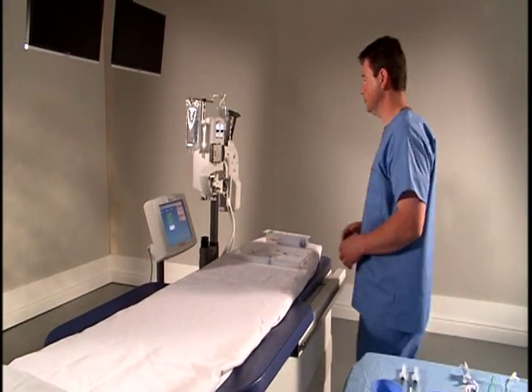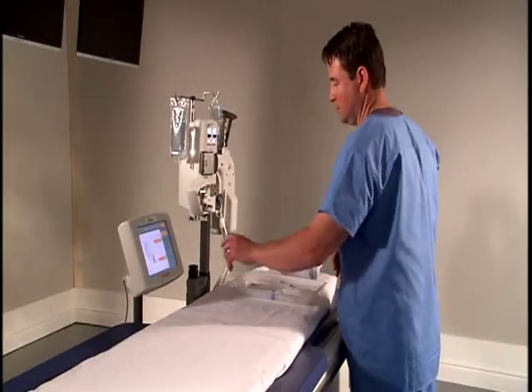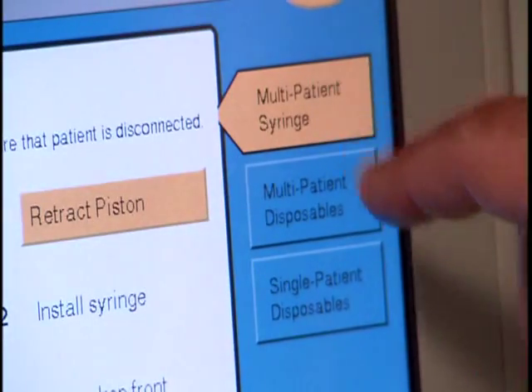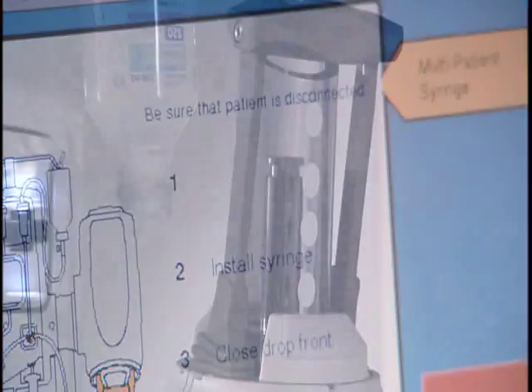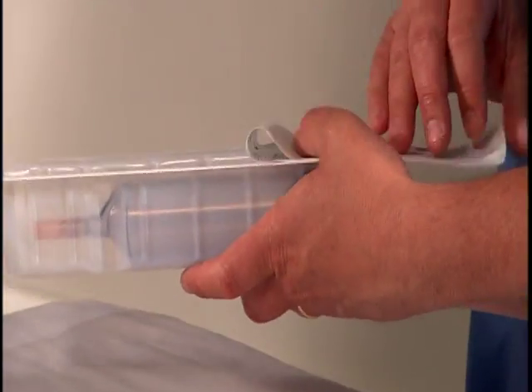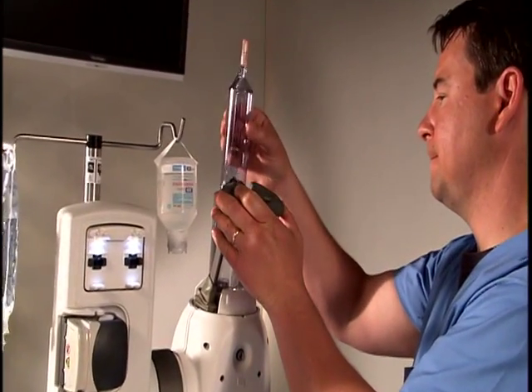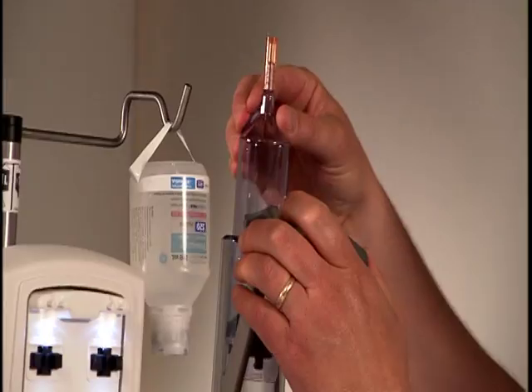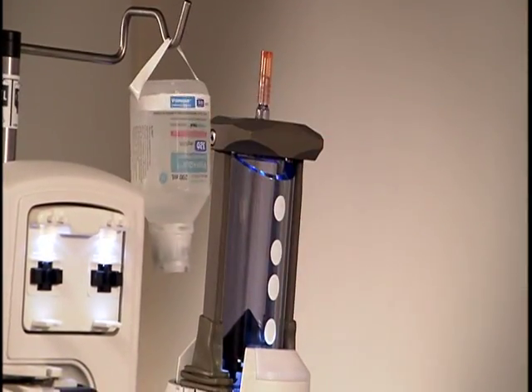To install a syringe, touch Setup on the protocol screen. A setup wizard will walk you through the steps. Touch Multi-Patient Syringe. Then touch Step 1, Retract Piston. During Step 2, orient the syringe to fit the keyed housing of the pressure jacket. Then insert the syringe. Perform Step 3 by closing the drop front arm.